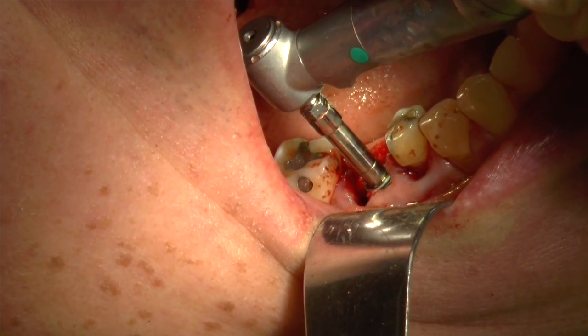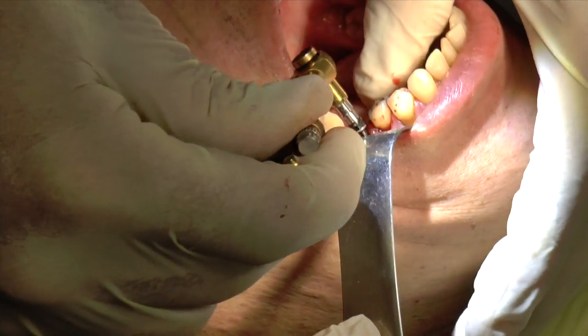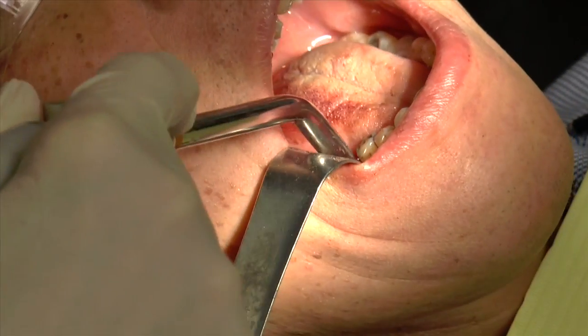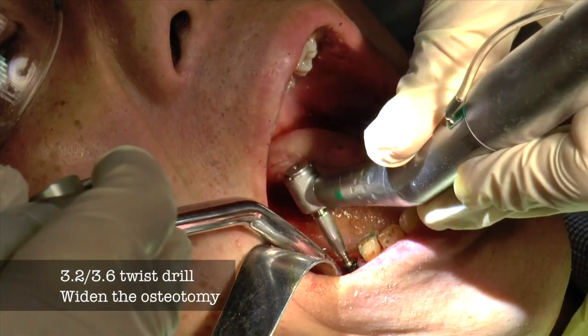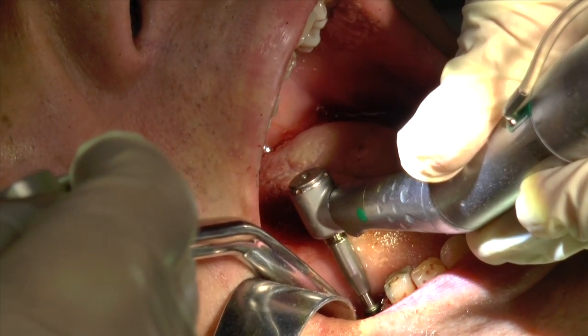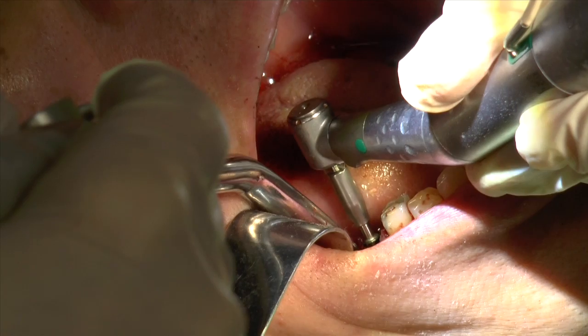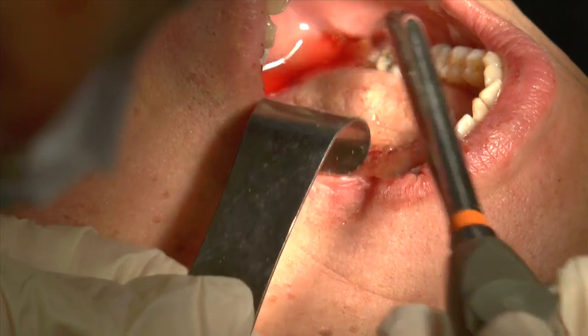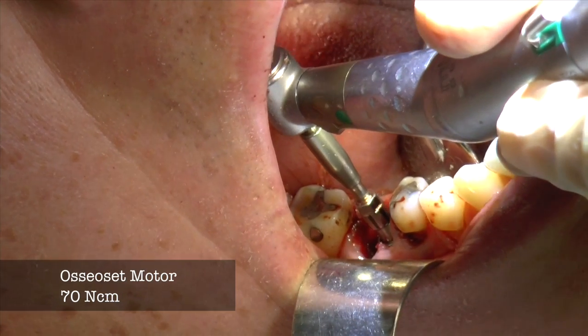Placing this in, you can see that on my first pass I'm not able to get this down to exactly where I want to be — I'm actually getting locked up because we're getting such stability on this implant. So I go and take this implant back out and re-prepare that area, because this is actually the first 5.5 I've put in and I was using principles from the 5.0 implant. Based on the feel of the bone, I'm going back in with a 3.2 and 3.6mm wide twist drill, preparing a little bit deeper because we're getting into more basal bone with some cortical qualities. Then we go back in and try to place the implant again. I'm looking at the apex of this implant — I do not want to lose stability on this particular implant if I prepare the osteotomy too large.